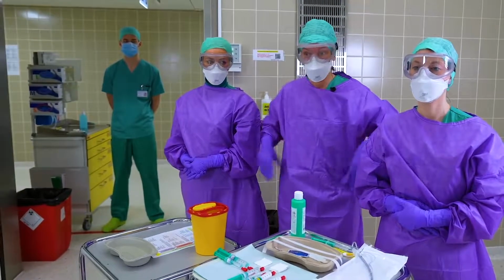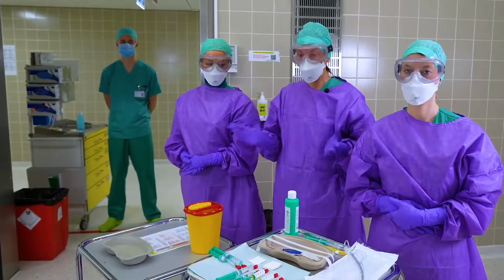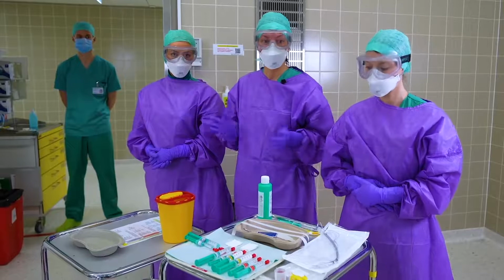Our concept is divided in 3 phases. We have the planning phase, intubation and extubation, as well as postoperative care. All these phases are equally important.